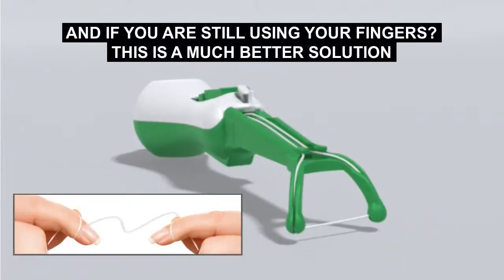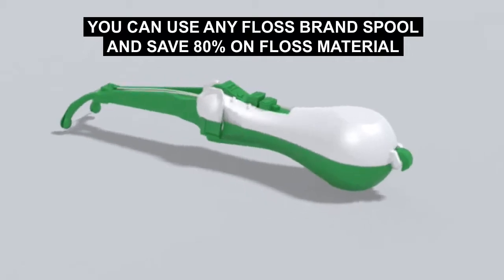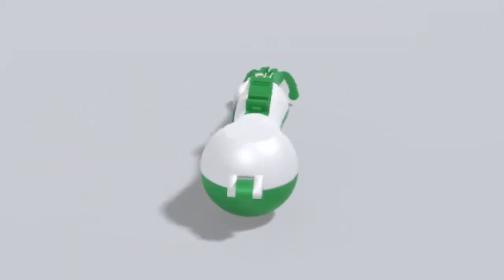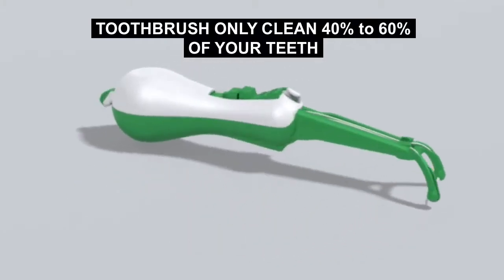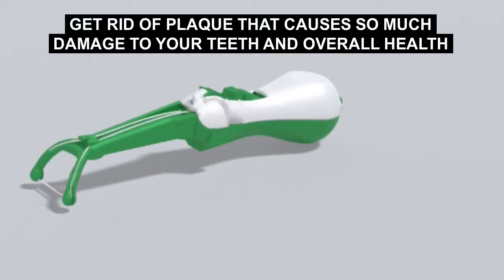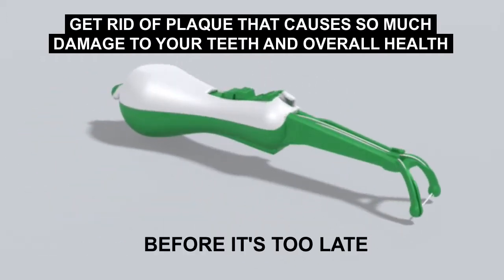And if you're still using your fingers, this is a much better solution. Use any floss brand spool and save up to 80% on dental floss, which helps the environment. Toothbrushes only clean 40 to 60% of your teeth. Get rid of plaque that causes so much damage to your teeth and overall health before it's too late.